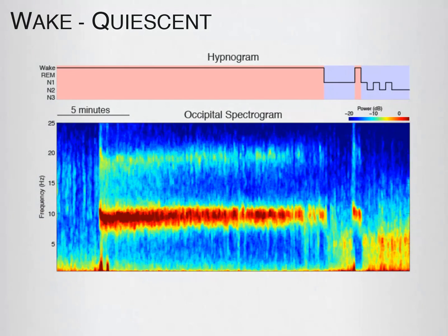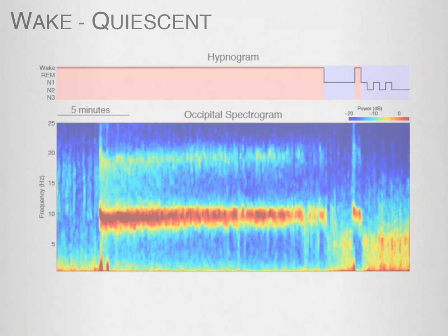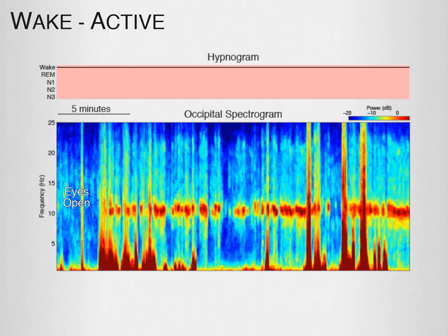This is quiescent wake as the subject is lying down and falling asleep. A lot of what you see at the beginning of the sleep record looks like this — eyes open, eyes closed with alpha. You also see these strong vertical bands representing motion artifacts as the EEG system gets moved or the subject moves. Every time you see this broadband noise with strong low frequencies in a vertical line, it lets you know that some motion has occurred.